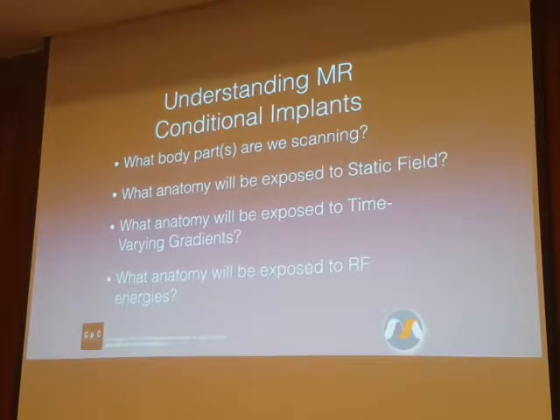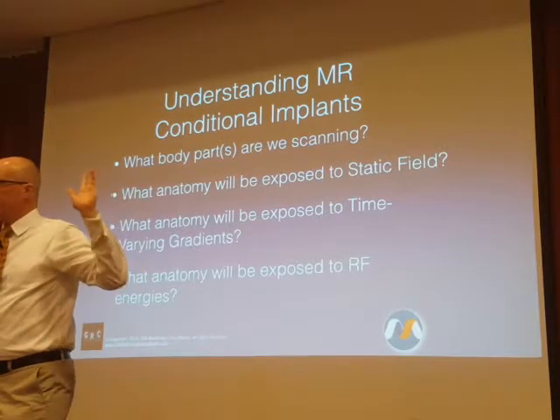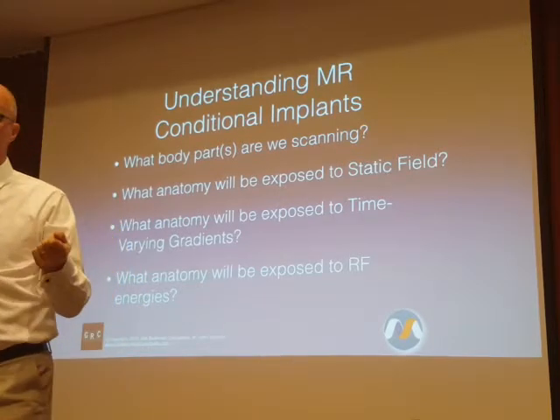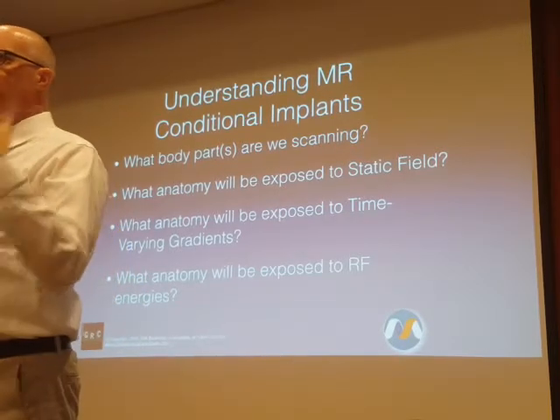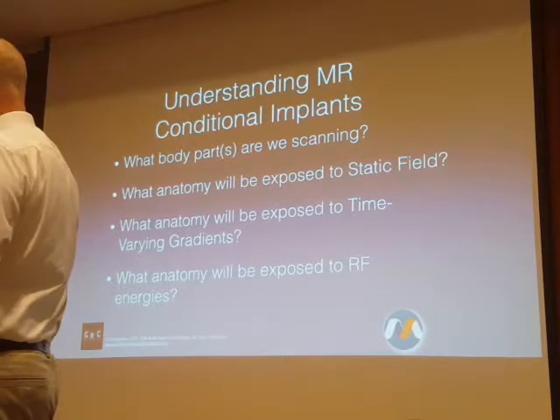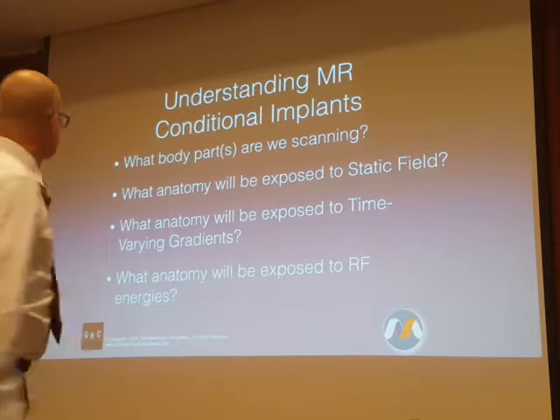When you do, it essentially means the manufacturer of that implanted device assures you that there's no undue risk to the patient. So when we go off-label and we don't have that assurance from the manufacturer, how do we determine if there's a particular risk for that patient?